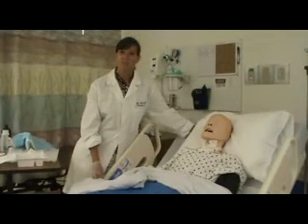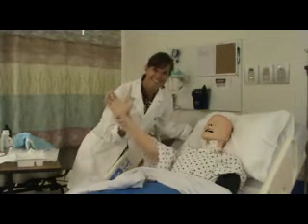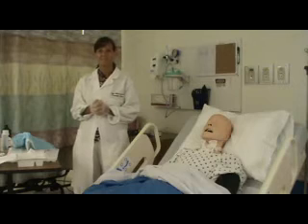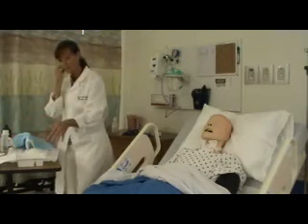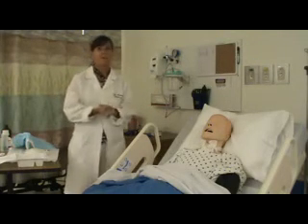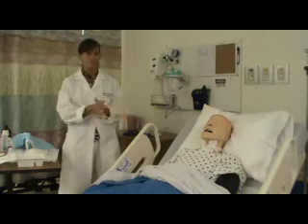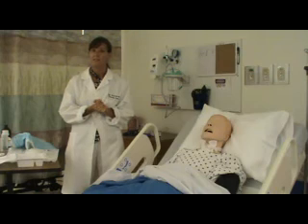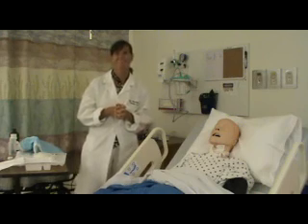This concludes our demonstration of tracheal suctioning. Of course, your students would probably leave the room by washing their hands. After we clean up our supplies, we would throw everything away before we take off our gloves, then perform hand hygiene. Ask the patient, 'Is there anything else I can do for you because I have the time?' Put the bed down to the lowest height, maybe put the head of the bed down, ask her wherever she's comfortable. Then go back to the nurse's station and document your nursing intervention.